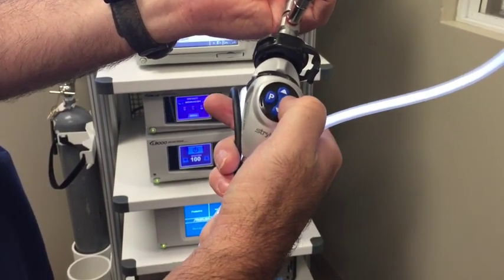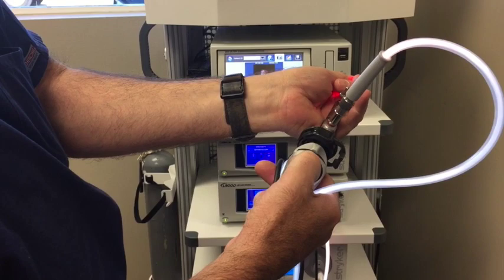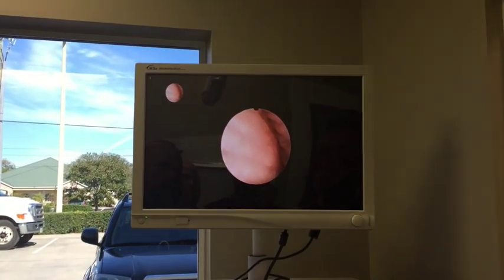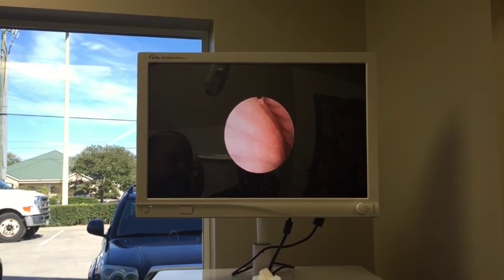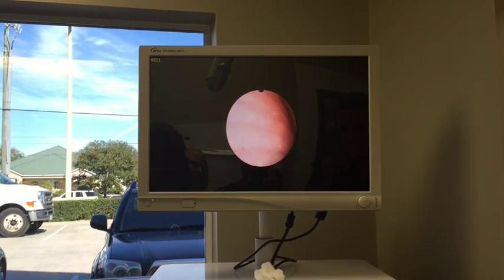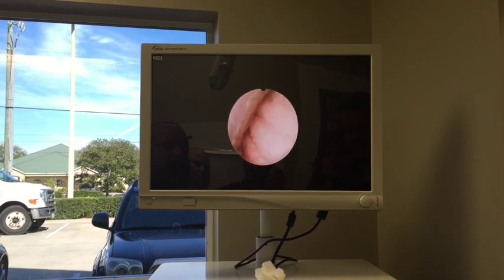If you just click the W button, it zooms in. Okay, the P button. If you click the P button, it takes a picture. Push and hold the P button. You hear the 2 beeps, that starts the recording. See up there, it says recording. Yeah. You can take a picture while it's recording.